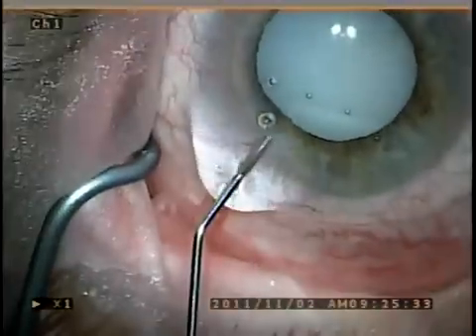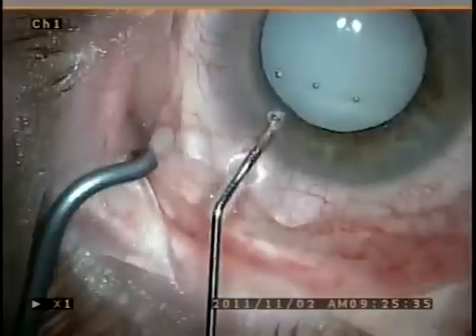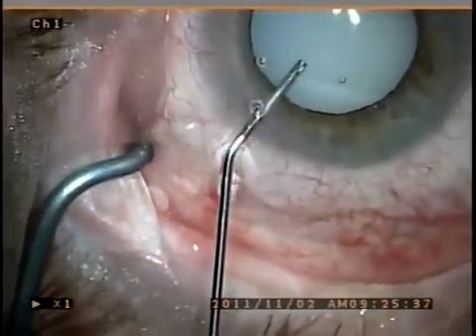This is Dr. Sidney Tyson, and I would like to share with you a video of the phacoemulsification of a dense mature cataract.